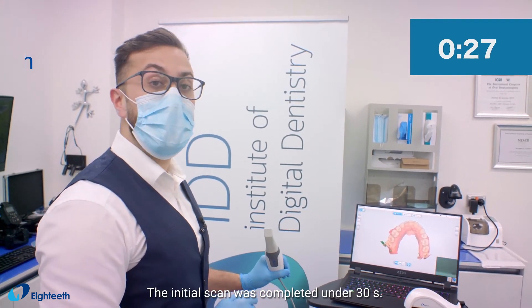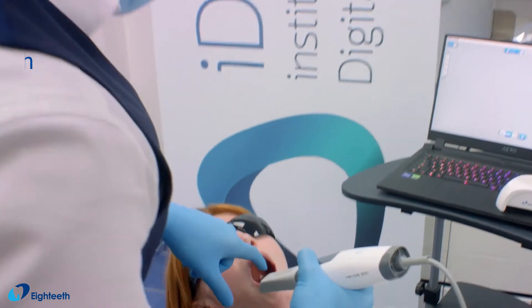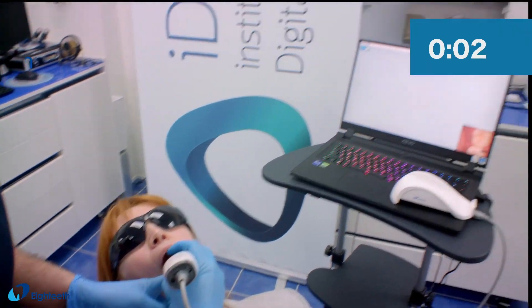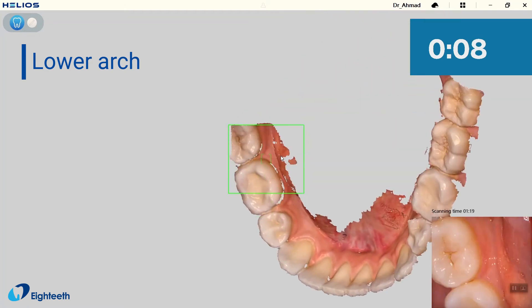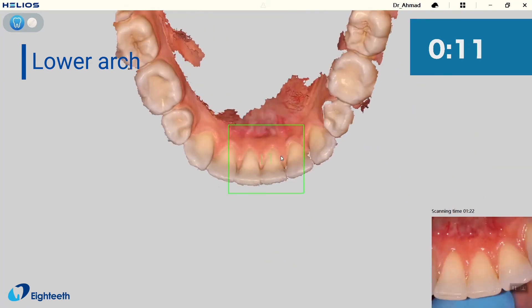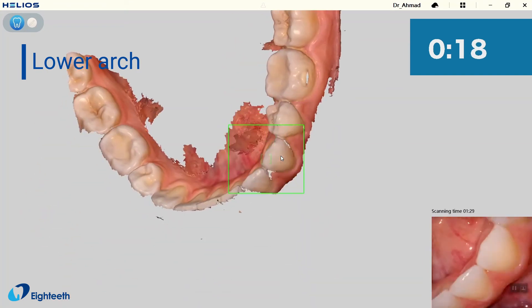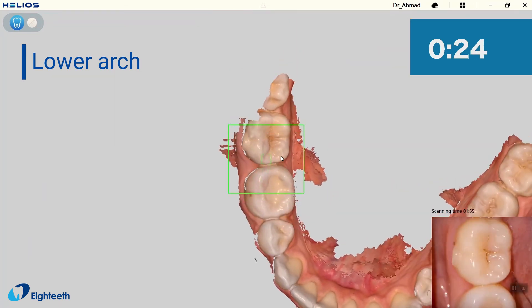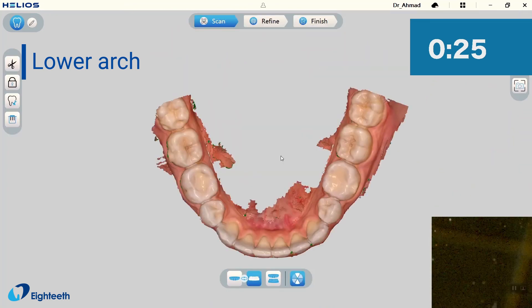The initial scan was completed in under 30 seconds. Now let's scan the second arch, which is the mandibular arch. That's another full arch scan completed, easily in under 45 seconds.